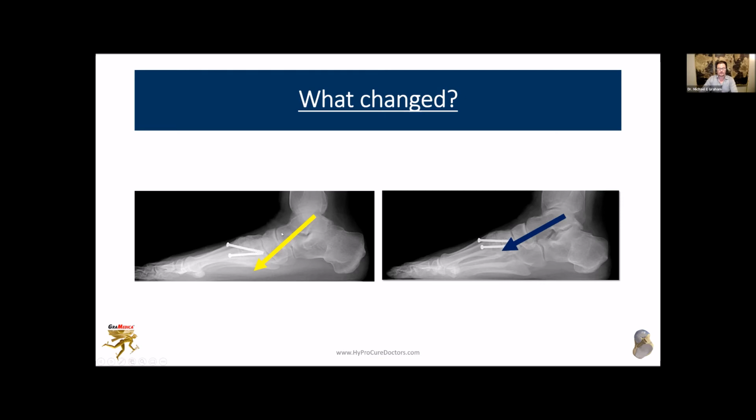The subtalar joints are no longer in constant congruent contact. We have a partially dislocating talus. Because of that, and this is also very obvious looking at the medial screw, it goes from a kind of horizontal position when the talus is realigned on the calcaneus to a more oblique or vertical alignment, because the navicular has fallen down, because the talus has forced the navicular out of place, and we're getting still this instability to the medial column of foot bones.